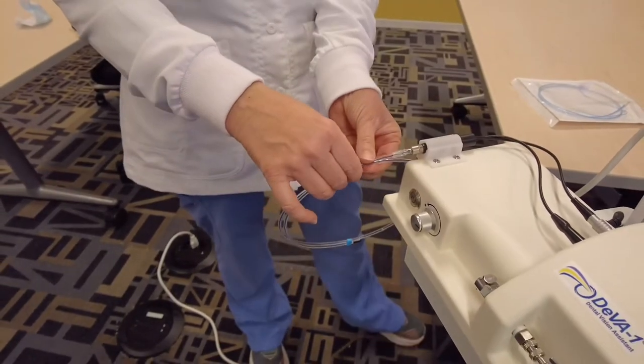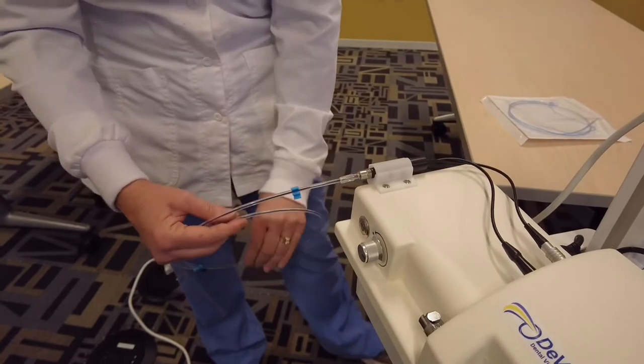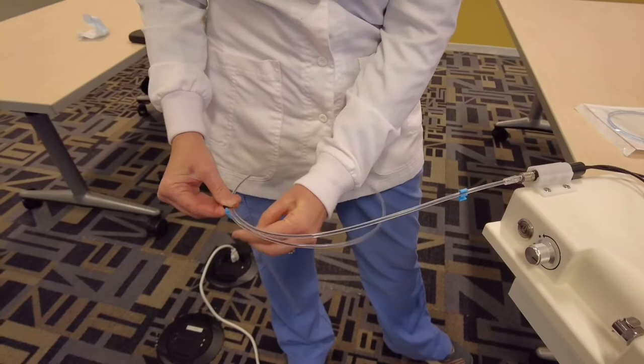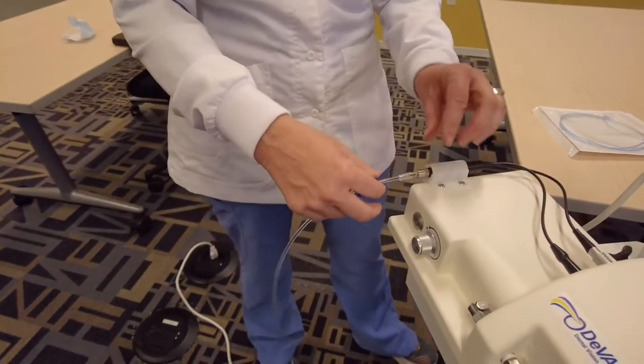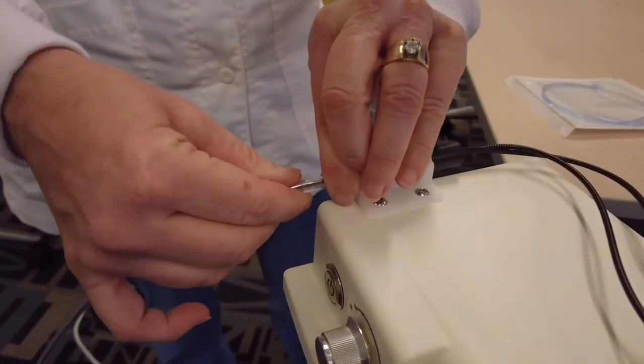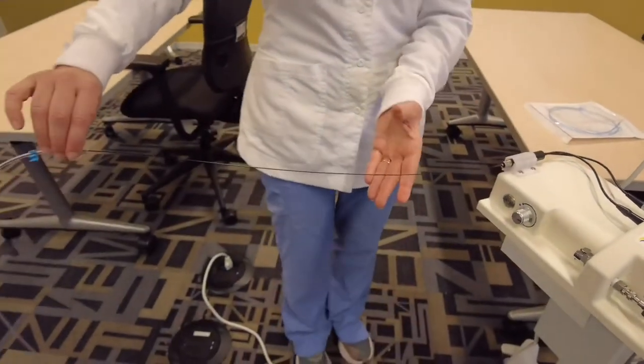When you're ready to seat a patient, you want to remove this by clasping the blue clasp, holding the fiber casing up here, and unscrewing and gently taking out the fiber.